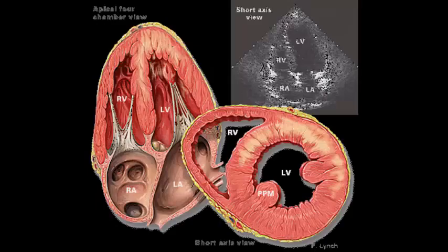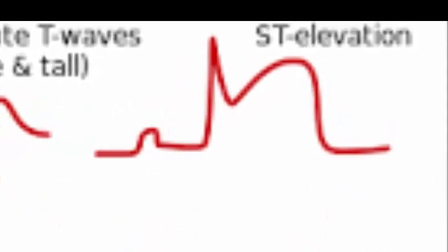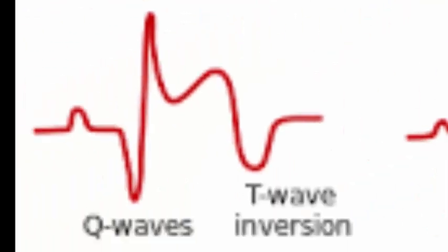The ECG in ischemia and infarction. When an area of the myocardium is ischemic or undergoing infarction, repolarization and depolarization become abnormal in that particular area. In transmural infarction, there is initial ST segment elevation, the current of injury, in the leads facing or overlying the infarct. Q waves or negative deflections will then appear as the entire thickness of the myocardial wall becomes electrically neutral relative to the adjacent myocardium.